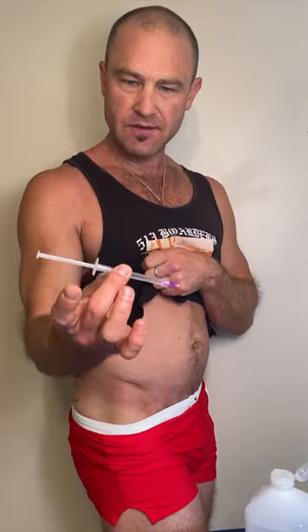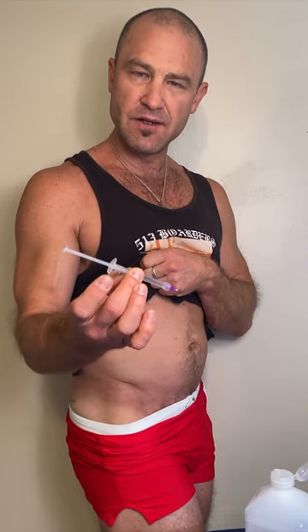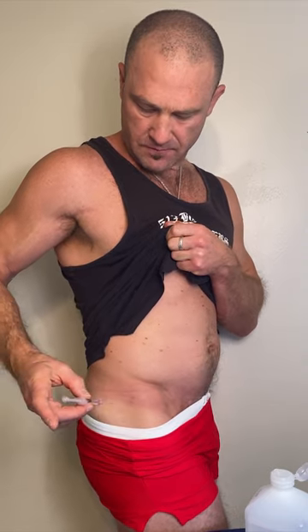What I like to do is lean against the wall so that muscle is not flexed — leaning against the wall, standing on my left leg if I'm injecting on that side. Remove the cap; the injection is already prepared. I typically like to hold it with two fingers — my middle finger and my thumb. Brace the injection, and in a darting motion, inject. Then depress the plunger.